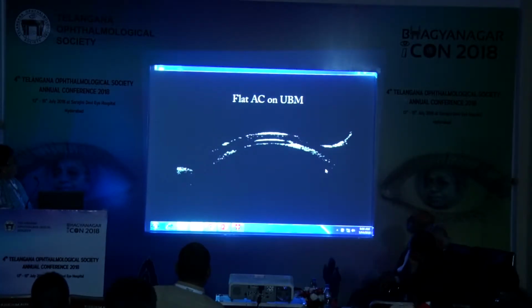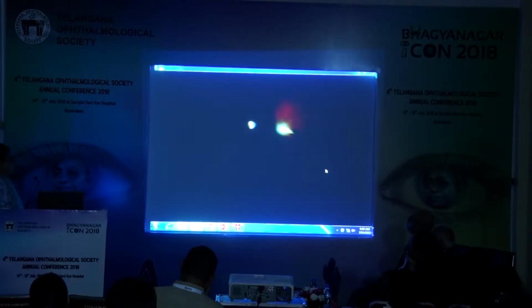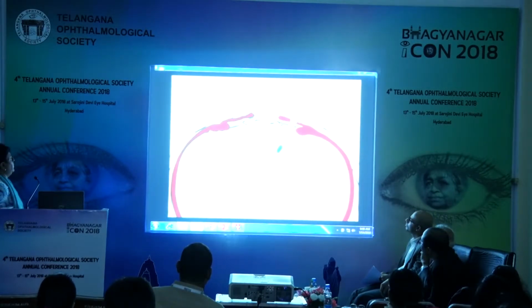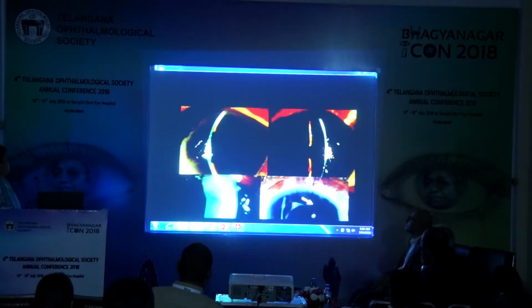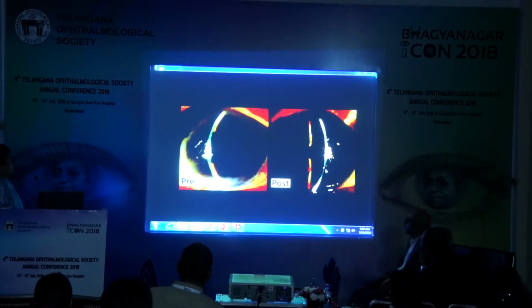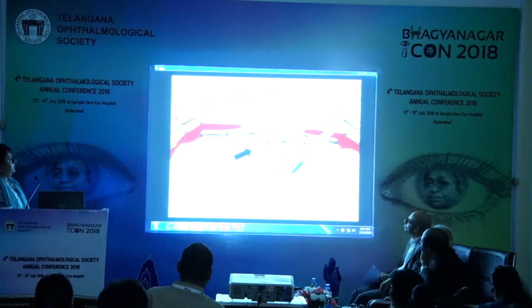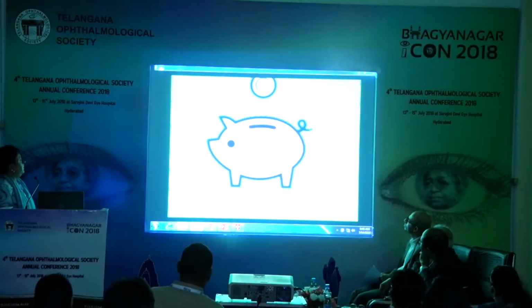Recurrence of aqueous misdirection is not unknown after pars plana vitrectomy and has been reported by several authors. It is perhaps a reflection of incomplete hyaloidectomy. We have a series of 9 eyes successfully treated with IZHV. We strongly recommend a complete anterior debulking of the hyaloid and disruption of the hyaloid face, made possible by use of an anterior vitrector using anterior vitrectomy settings by an anterior segment surgeon, thereby reducing the burden on the resources and skills required in a vitreoretinal procedure.